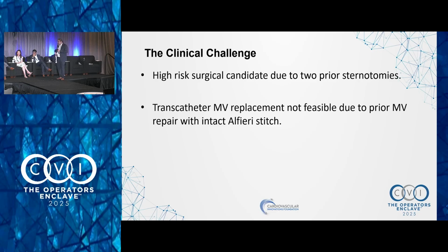Which is unusual. Usually if a surgeon's going to do it, they'll just close the whole commissure off. I wonder, in the original surgery, did they actually close the whole lateral commissure, or was it literally a focal edge to edge? It was probably done for SAM though, right? It wasn't for SAM, it was for MR. Alfieri for MR, primary only.